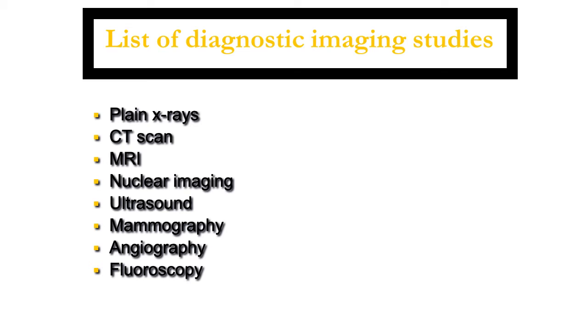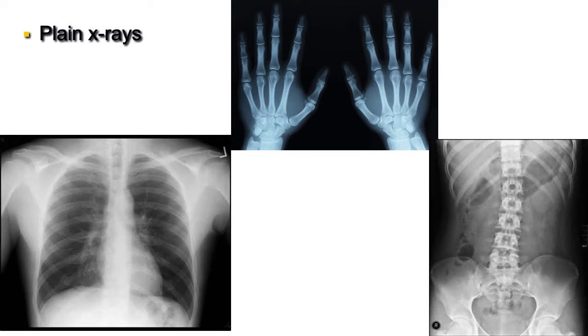On your left we have a chest X-ray. In a chest X-ray, you can see the lucent area is the air in the lungs. So lungs are filled with air, so they are lucent. In the middle, we have the spine and the mediastinum. You can see it's opaque. Remember that. The same thing in the hands: we have bones and soft tissue. You can see the soft tissue is opaque, but not as opaque as the bones. Remember the soft tissue and fluid density.